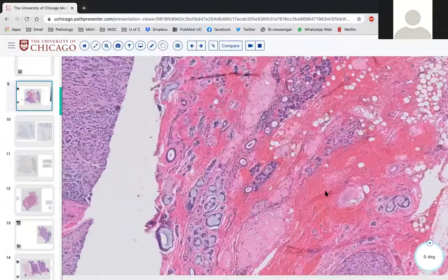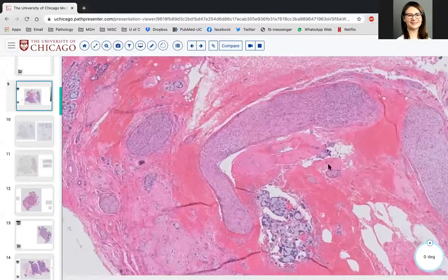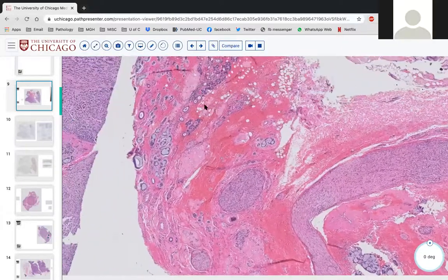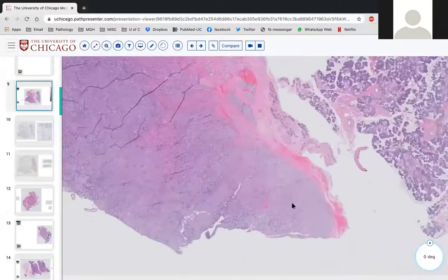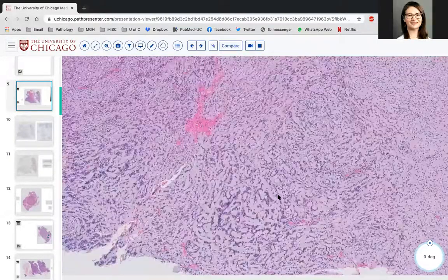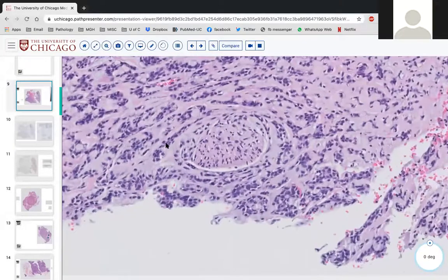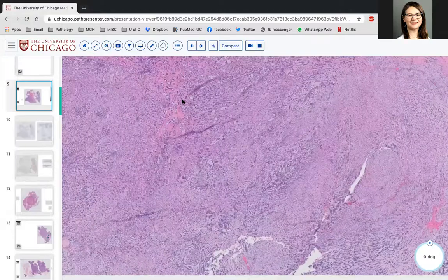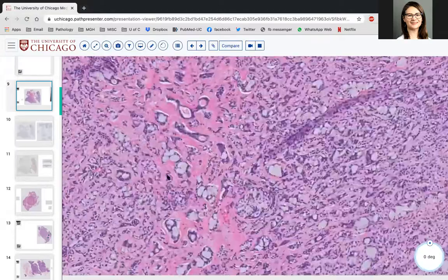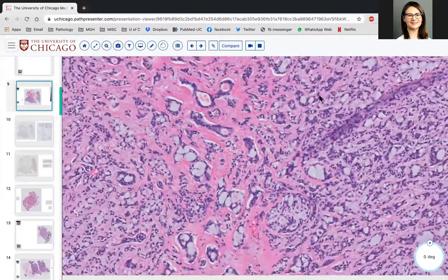Yeah. And is that a nerve possibly there? Yeah, so it looks like if there's nerve infiltration, that's definitely not a PA at this point. Yeah, so I'm gonna call this an adenoid cystic just based on morphology or previous immunostains and nerve involvement. Excellent. Yeah. So this is one where the more characteristic cribriform morphology was really not present very much on the core, is only present in very small bits on the resection, as you can see here.